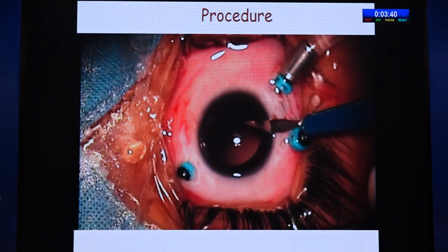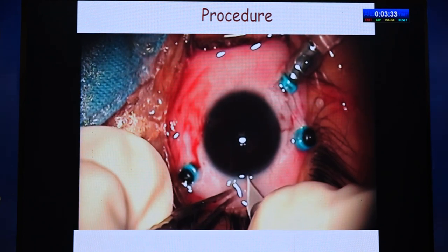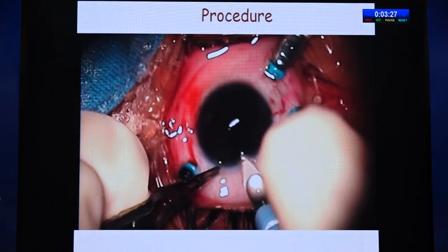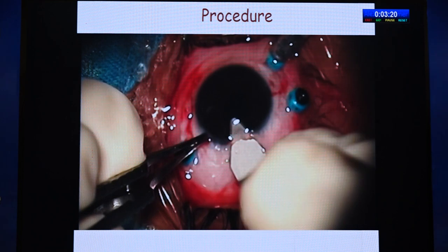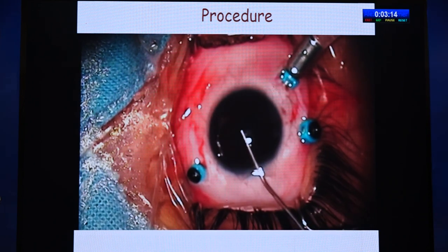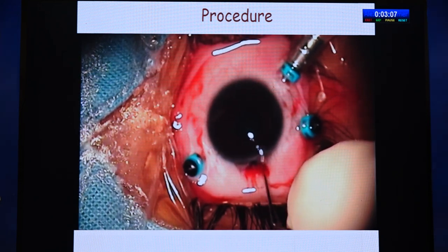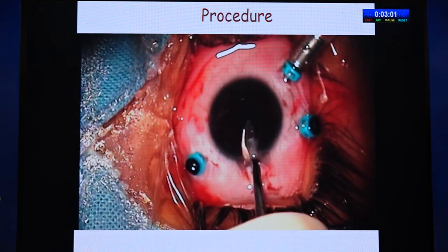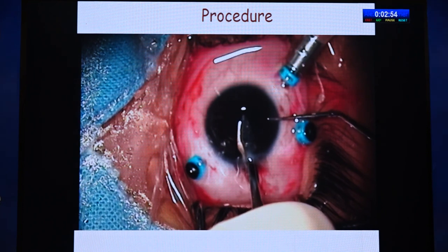Now, coming to the procedure, the majority of the time I do it as a secondary procedure, or sometimes with the help of my colleague, I do it as a combined procedure. My first step is always a side port; especially in a vitrectomized eye, it is better to do the side ports first. The incision can be either temporal or superior, corneal or scleral. I always prefer a superior corneal incision to save the conjunctiva in case you need any future trabeculectomy. Also, in a scleral section the AC might collapse. The AC stability is better in a corneal incision.